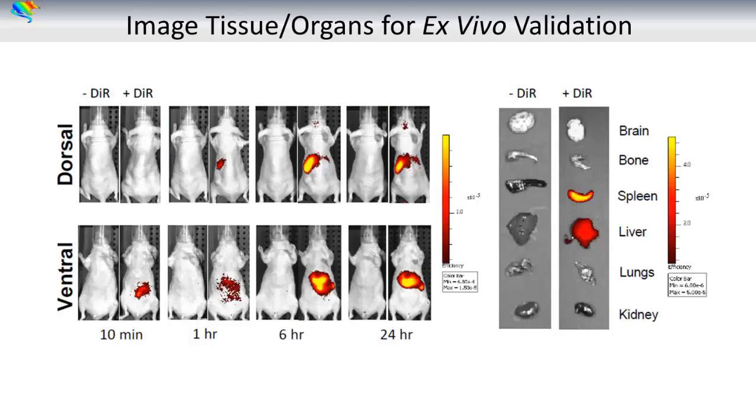After your last in vivo image, sacrifice the animal and necropsy tissues and organs. These can quickly be imaged in the IVIS in a quantitative manner and are therefore a fast and effective validation method, especially of imaging in 2D where we do not have depth assessment of the source.